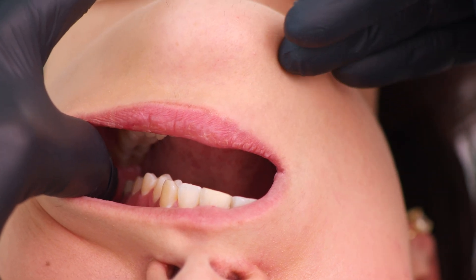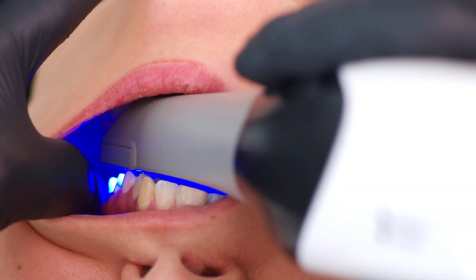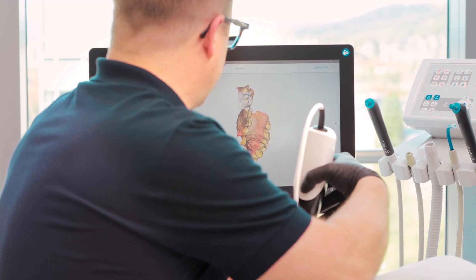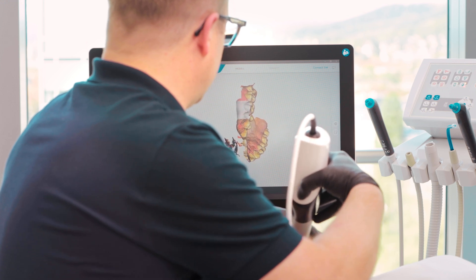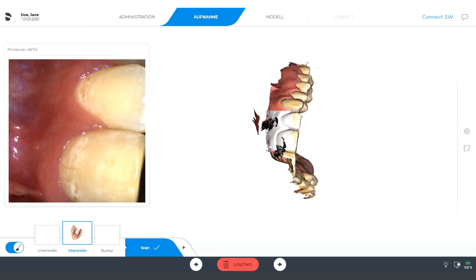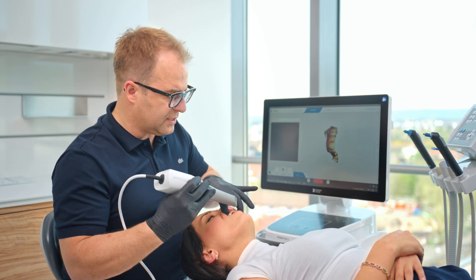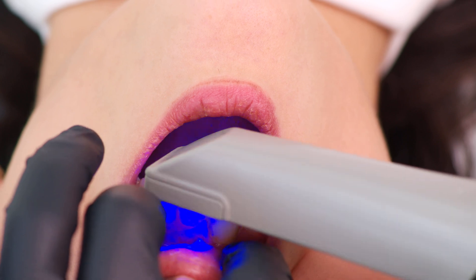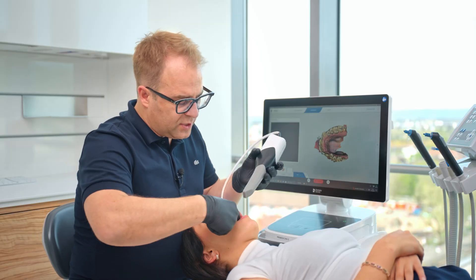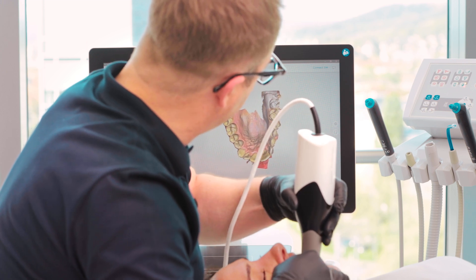You can close now a little bit. Move your jaw to the left, please. Open just a little bit more so that the scanner can enter. Now move to the left. I will get more space for scanning. We continue here with the buccal part and the labial surface of the incisors. I will roll over the incisal edges to get a nice accurate scan here. We do this jaw movement to the right now. Here I move to the buccal — I have more space now.